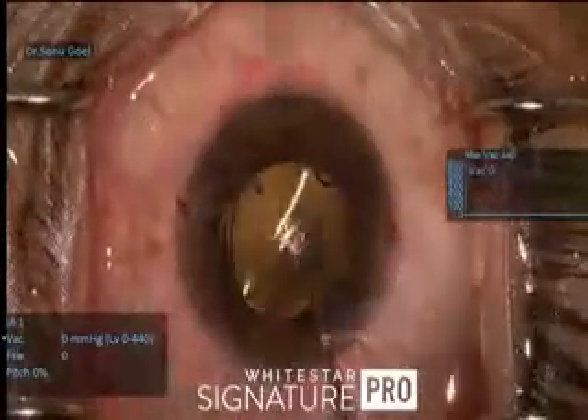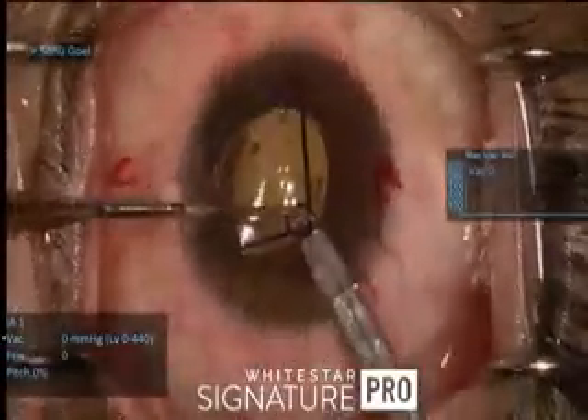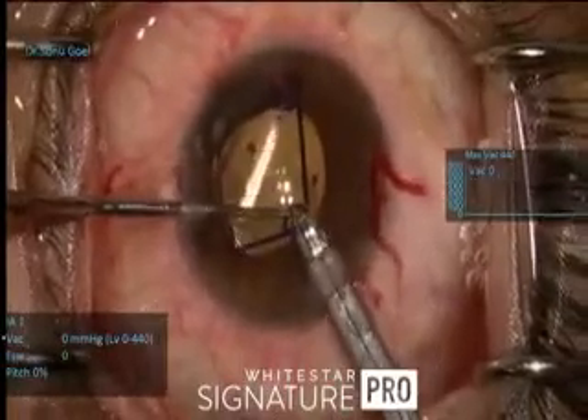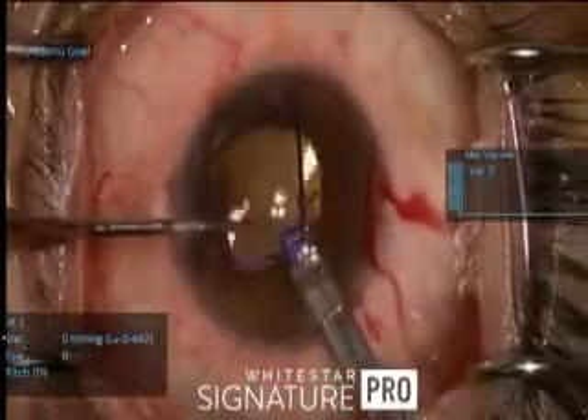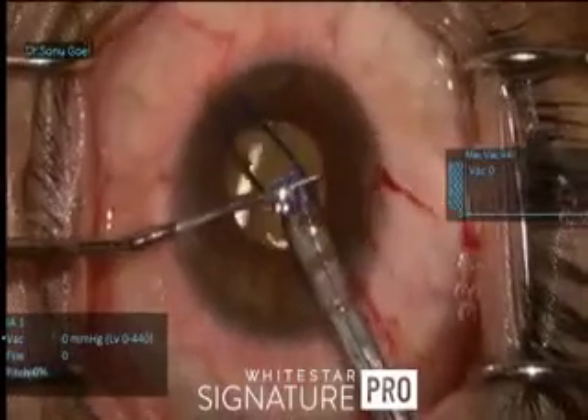At this point the delivery system of the Malyugin ring comes in, and this is how it is nudged inside. The trailing end gradually goes in, is withdrawn, and the Sinskey hook acts as a guide to push it back into the system.